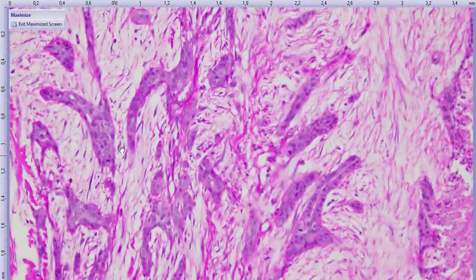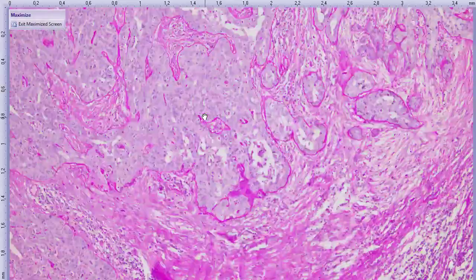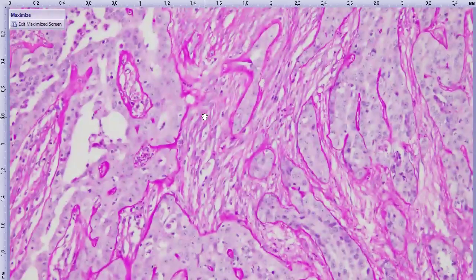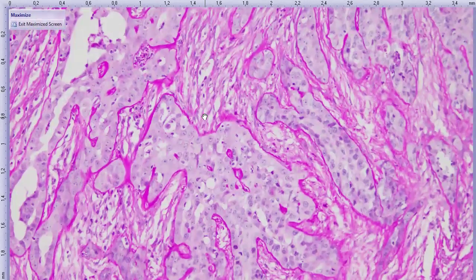And you can see some of that here, but it becomes pretty neat at that more obviously epithelial area right there. Look at that. We did offer immunohistochemistry. They did not answer yet. We would go and do that. Dr. Breaker has a comment. Yeah. She said that they had a suspect pleomorphic iridociliary adenocarcinoma yesterday that was positive for Melan-A and PNL2.